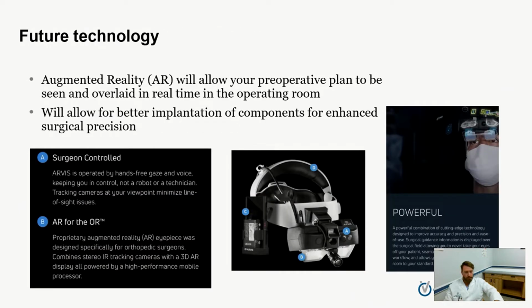In the future, we'll be moving not only from 3D implantations and 3D customized implants to augmented reality or virtual reality and robotics in shoulder replacements. My next step in the OR is going to be augmented reality. Augmented reality is very nice because by using the headset that's pictured in the middle of this slide, I'm able to view your CT scan and my preoperative plan, which I spent time putting together and knowing exactly where your components are going to be.